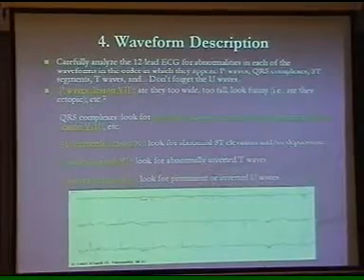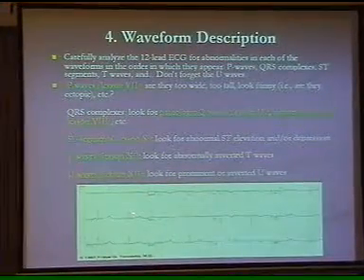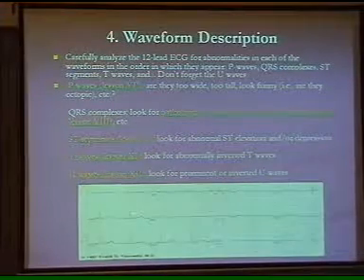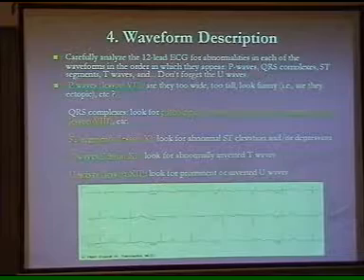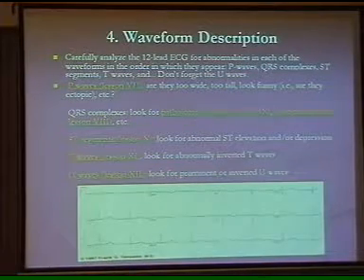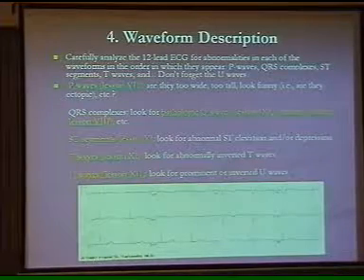Right. Now, I think it's a little bit fuzzy here. It'll be difficult for you to do the exercise here, but basically how to calculate the heart rate on this ECG, for example. Can somebody volunteer?